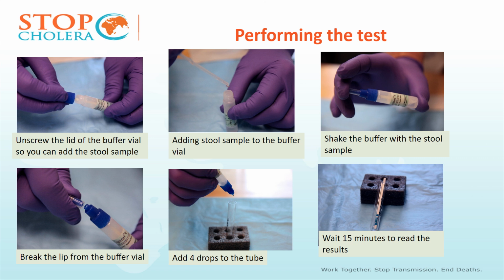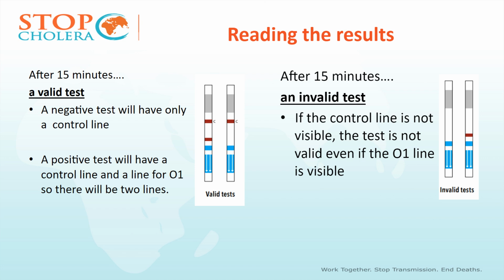Either this slide or the previous slides may be printed and used as a poster to show the steps in the test. After 15 minutes, it is time to read the results. The instructions indicate 15 to 30 minutes, but in general, the results are clear within 15 minutes. Do not read the results at a later time.